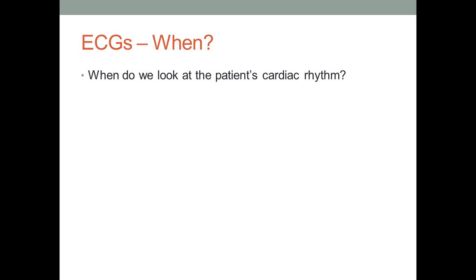But just keep in mind that some patients are just too sick for an ECG rhythm and you need to get going. In that case, there's a delay to an ECG rhythm, and that's okay. Maybe it's in the truck, perhaps the patient's VSA, and you just never get to it. And that's okay too. It's just a matter of prioritizing what's important for that patient at that time. And perhaps it's load and go.